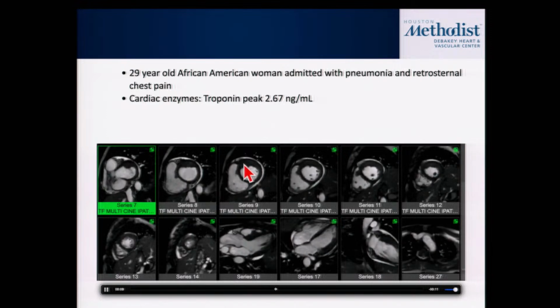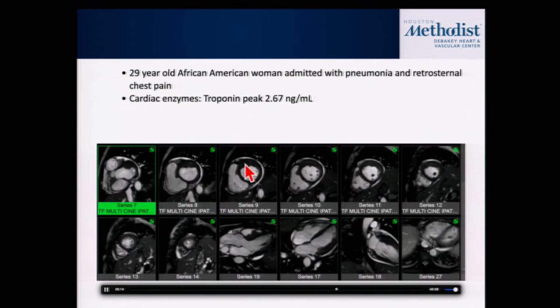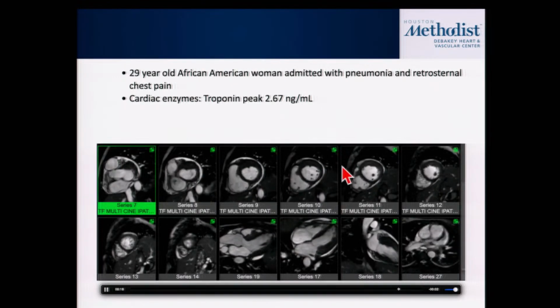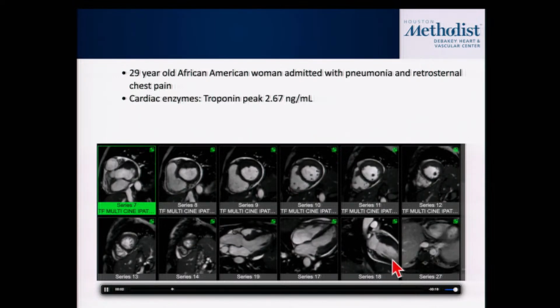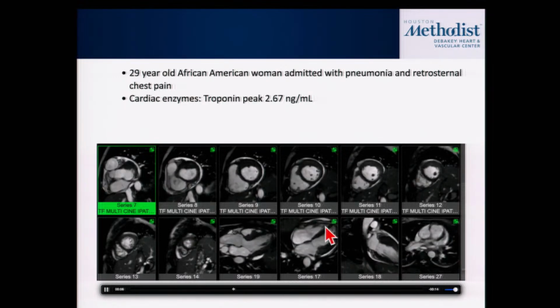Okay, so very good. If you look at the wall thickness here and just go around the circumference, right? The anterior wall is much, much thicker than the inferior and lateral wall, right? You can see that on the basal as well as kind of on the mid slices. And you can see here it's a little bit cut off, but on the two-chamber view, right? You can see the basal and mid slices. Wall thickness is much thicker than the other areas. Anything else?